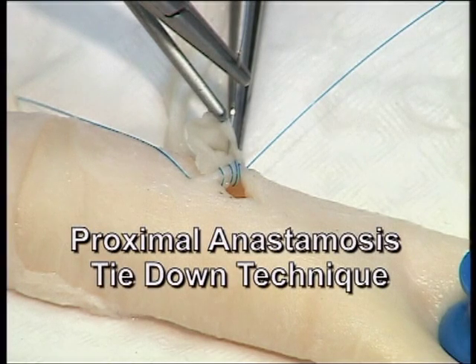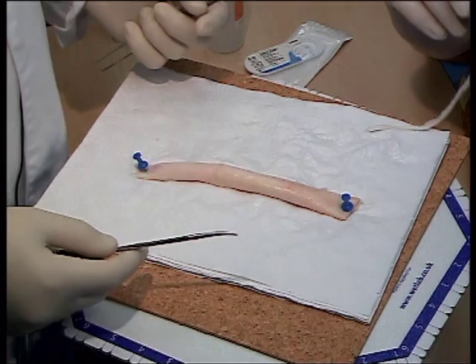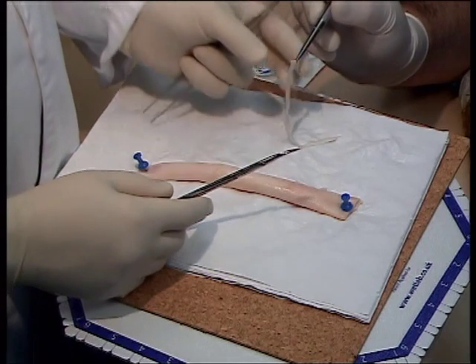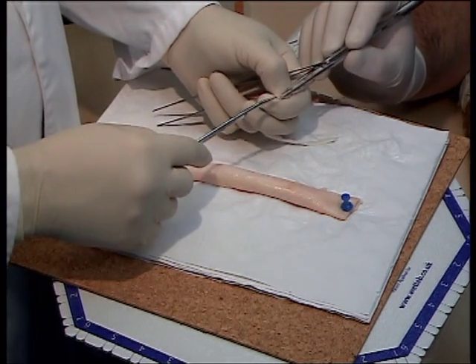Proximal anastomosis tie-down technique. For this procedure you will need a piece of descending aorta and a piece of ureter. The instrument list is described in your workbook.